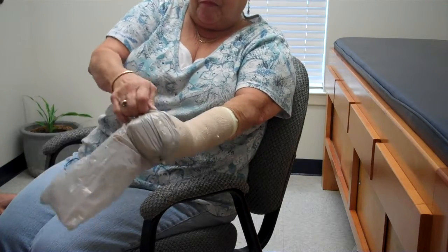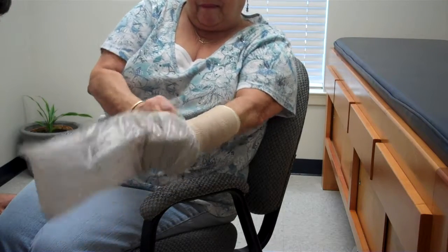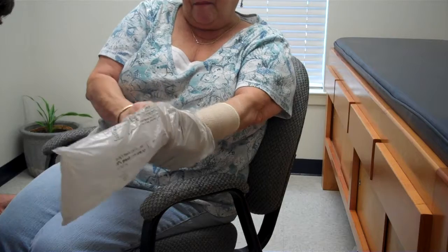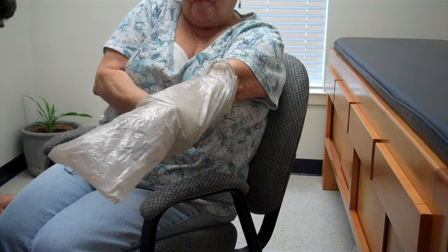She's got what we call a gauntlet cast, which makes it a little bit more difficult to get this newspaper bag over. But this is all we're using — just a newspaper sleeve. Most of us have these with our paper.